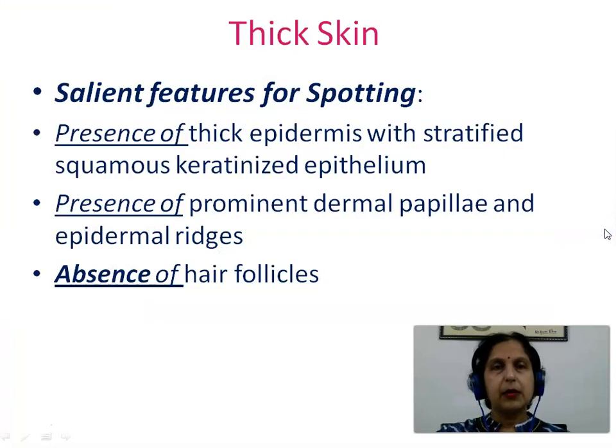The salient features for spotting a slide of thick skin would be presence of thick epidermis with stratified squamous keratinized epithelium, presence of prominent dermal papillae and epidermal ridges, and absence of hair follicles.